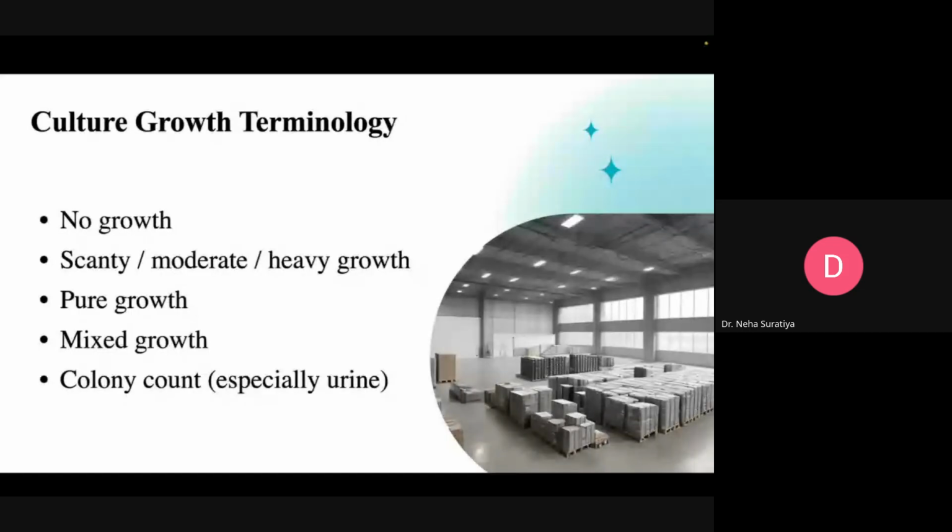So we need to understand whether it is a significant UTI or a contamination type of UTI. The range of this colony count gives you an idea about what type of UTI a person is having. For your understanding, I am saying, because I remember the range right now: 10 raised to 5 CFU per ml is a significant UTI. If colony forming units per milliliter shows 10 raised to 5, it is a significant UTI. While if it is less than 10 raised to 5, and 10 raised to 3 CFU per ml, that is contamination and not significant.